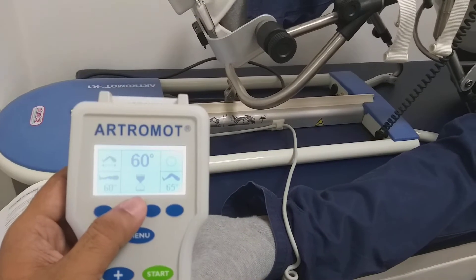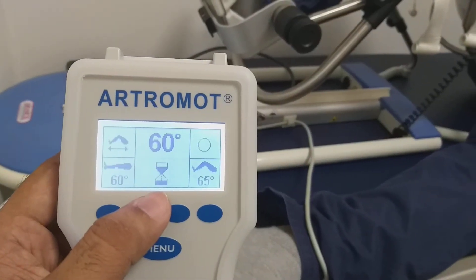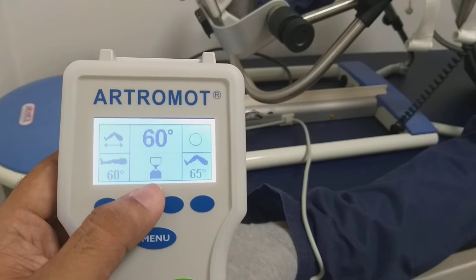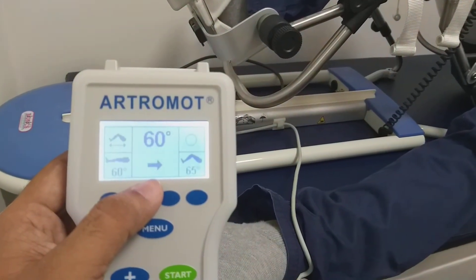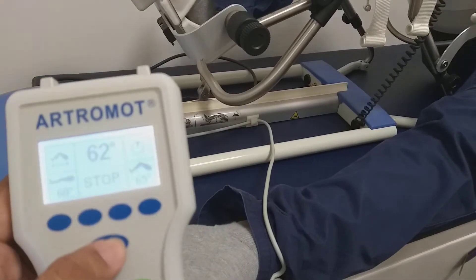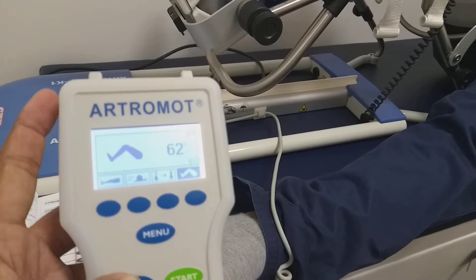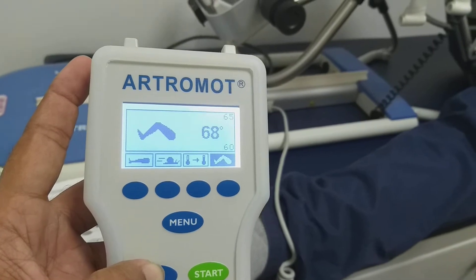So now the treatment starts. There is a pause. After the pause time finishes, it starts flexion. I will increase the angle a little. I also want to increase the pause time.